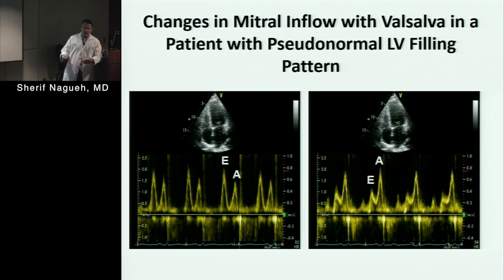The problem with the Valsalva, it takes time to do. It's difficult to standardize. Some patients will not cooperate. So in special situations, it may be done in our lab, but there are labs that have it routinely. Overall, pretty specific if you see it, but sensitivity is not that great.